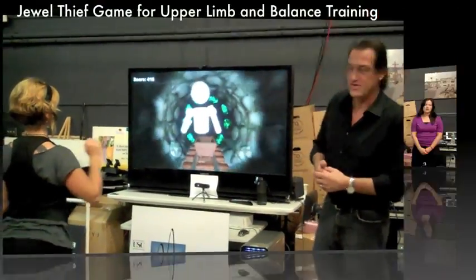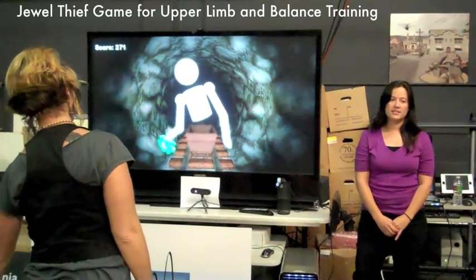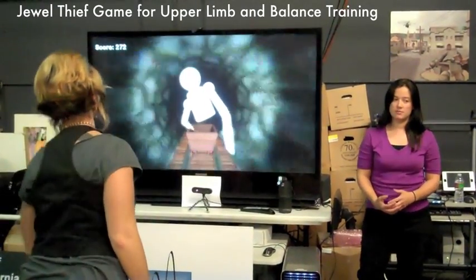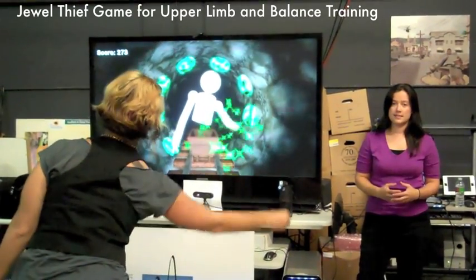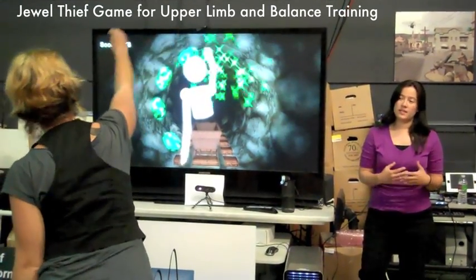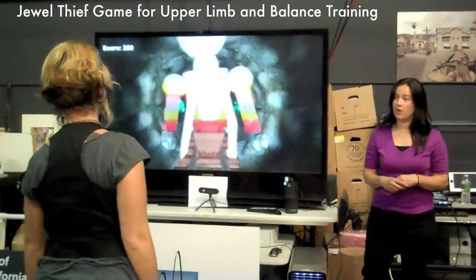The game encourages the player to reach for gems, and we can tailor the placement of these virtual stimuli within the game for people with different levels of balance ability. We can assign the gems to light up in different patterns depending on the therapeutic goal.